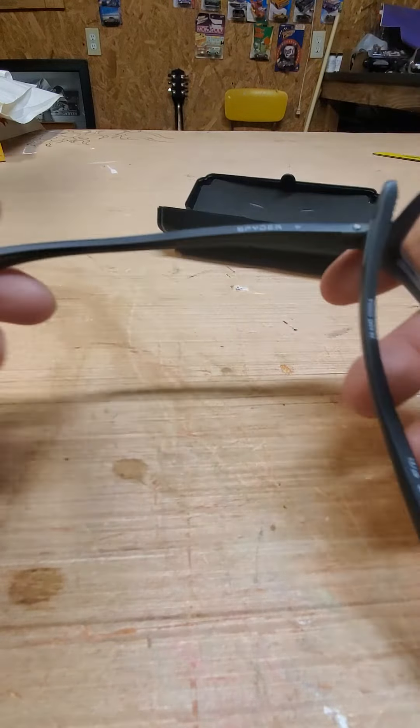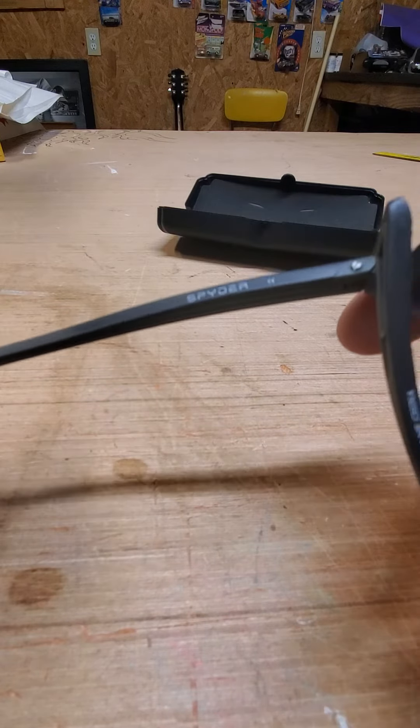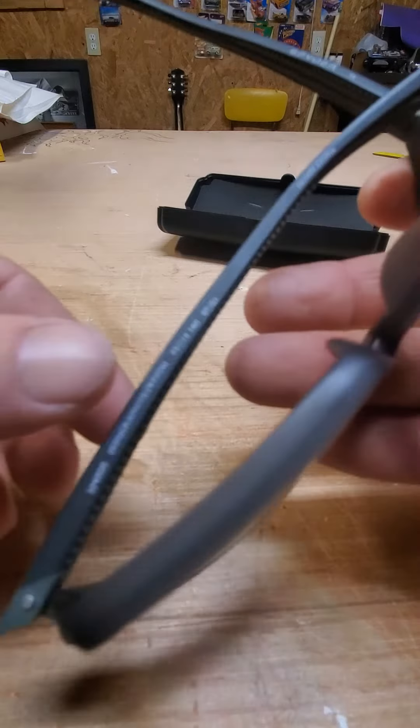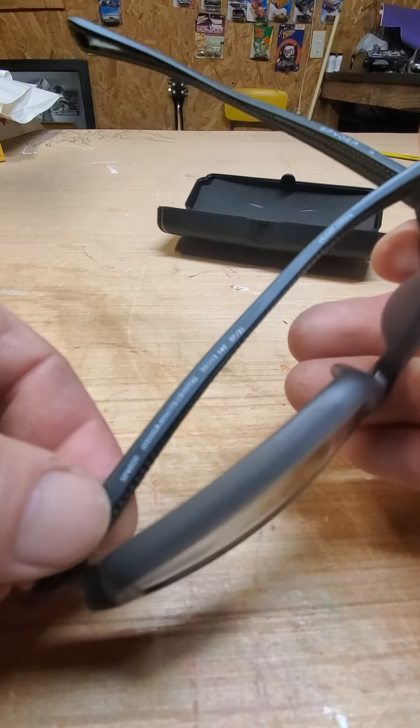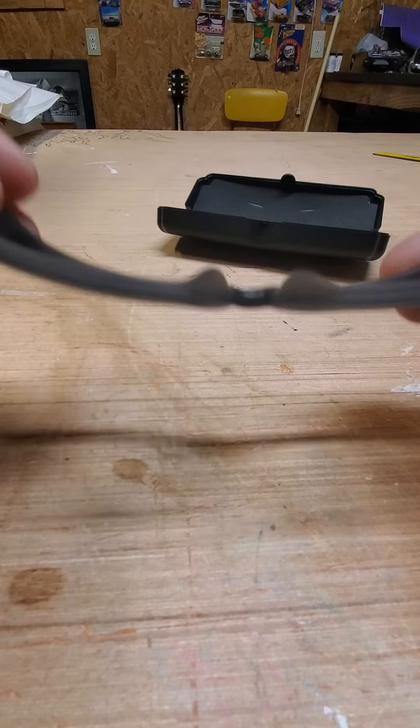Like I said, this is the Spider. The frame is made in China, as with everything else in America. So this is my review of them — they're very, very lightweight.